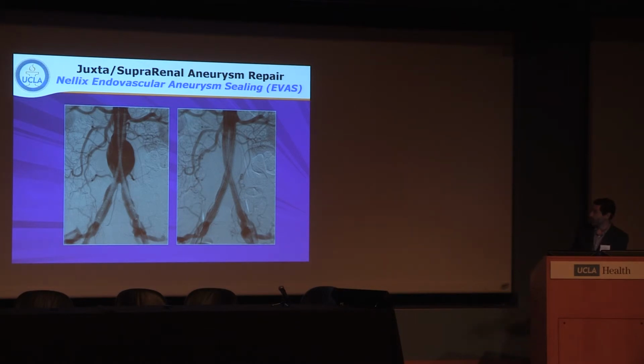The advantage of this device, I think, is that it really doesn't require a lot of proximal fixation for your endograft. So potentially this could be employed for very short-necked aneurysms, in part because this polymer bag fills the aneurysm sac itself.